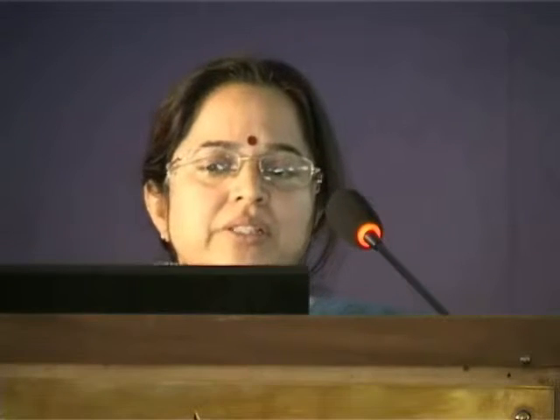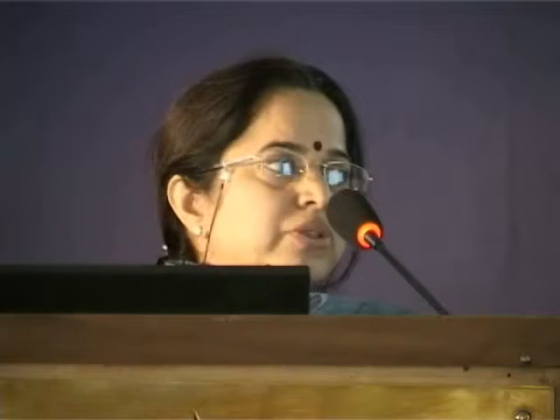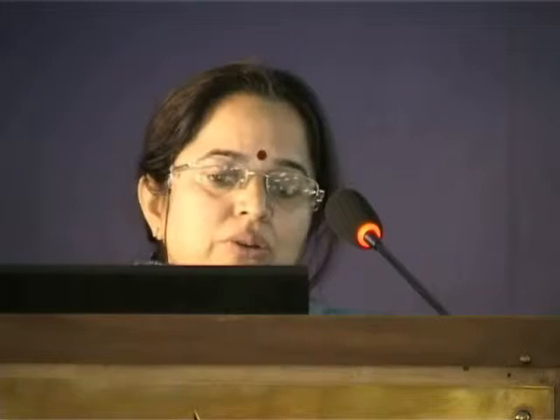We have an array of techniques which are used to identify infection. To start with, gallium-67 citrate, with the different methods of localization shown, and most of these techniques are very non-specific. They go to infection and inflammatory processes: gallium-67, radiolabeled leukocytes, either with technetium or with indium, polyclonal immunoglobulins. Monoclonal antibodies have been tried, some peptides, nanocolloids, streptavidin-biotin complexes tagged to technetium or indium have been used, and of course F18 fluorodeoxyglucose.